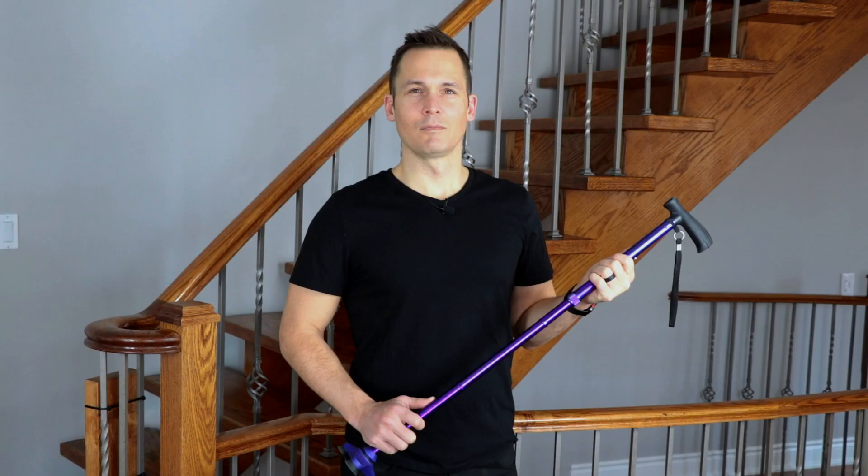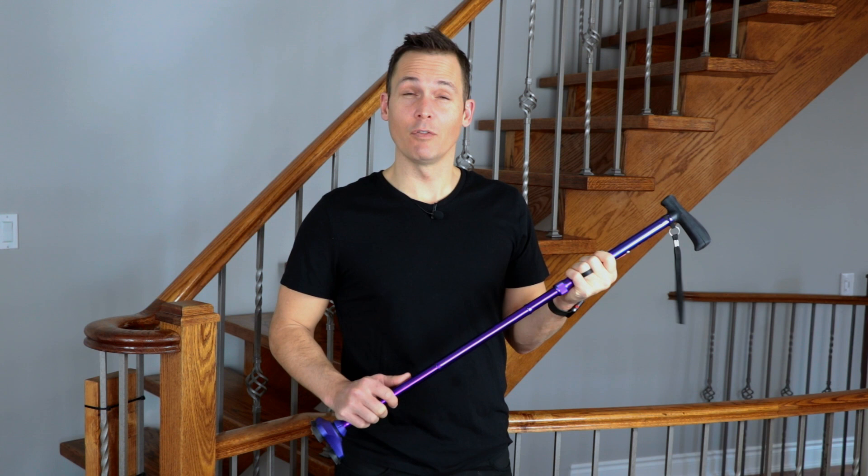Hi, I'm Adam Brown and I'm a physiotherapist with Therapia. A cane can be an excellent way to take pressure off of an injured limb or prevent a fall. Today we're going to cover the use of a cane on flat ground and while climbing stairs.